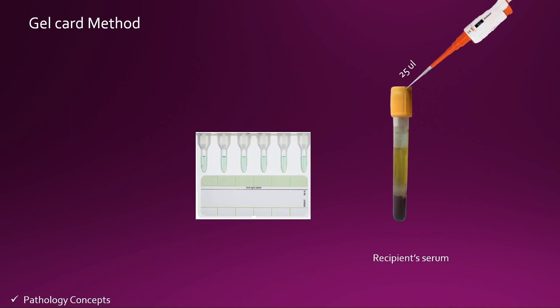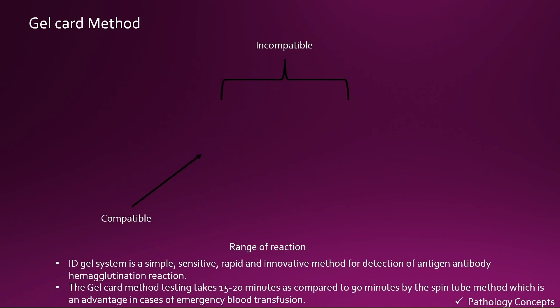Now take the recipient serum and add 25 microliters of recipient serum into the same gel card column. Incubate at 37 degrees for 15 minutes. After 15 minutes, centrifuge the gel card and read for the reactions.